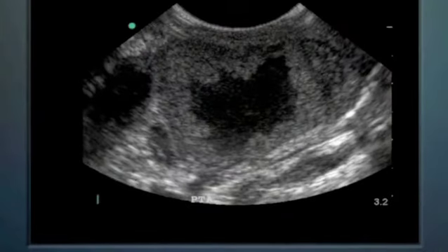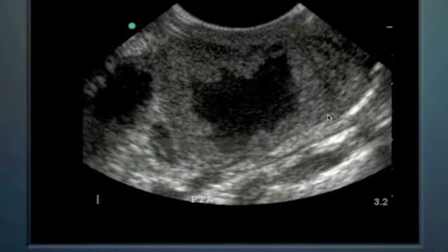This is a very large peritonsillar abscess. We see over here that these are 0.5 centimeter hash marks, so 0.5, 1, 1.5, 2, 2.5, 3, a little bit more gives us to 3.2 for the depth. And so this is measuring about a 1.5, almost a 2 centimeter in its longest axis diameter peritonsillar abscess. You think about that, it's a very large one here, very prominent, and this is the intracavitary transducer we have in the mouth, and we can see this very prominent peritonsillar abscess here.